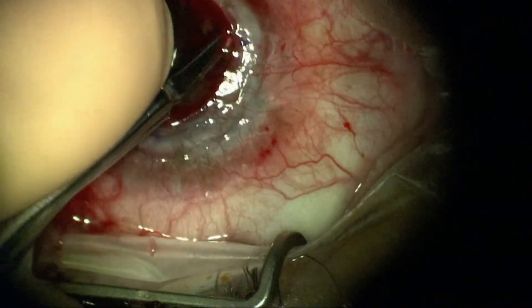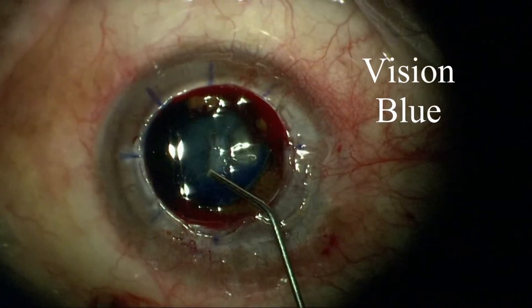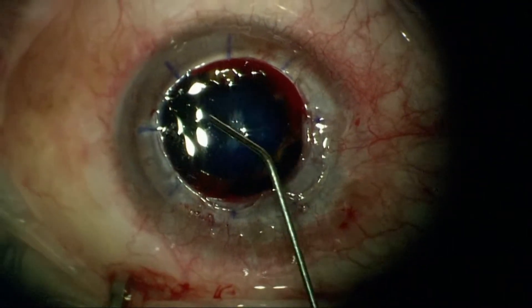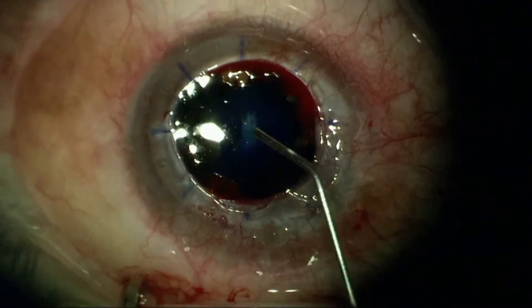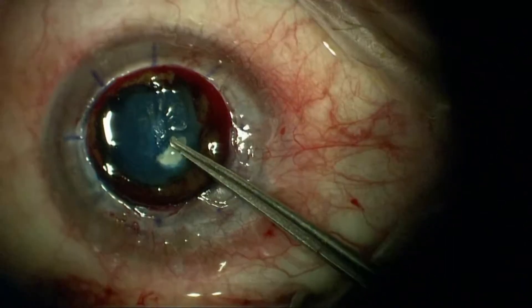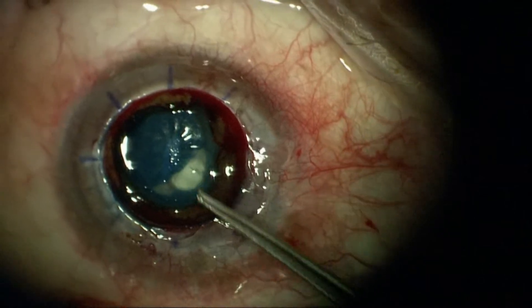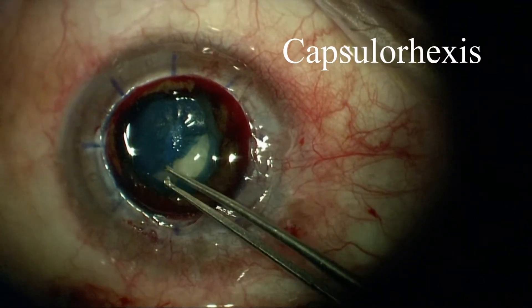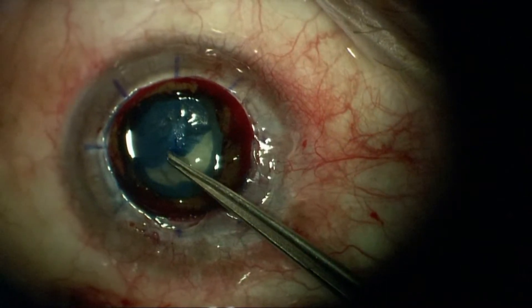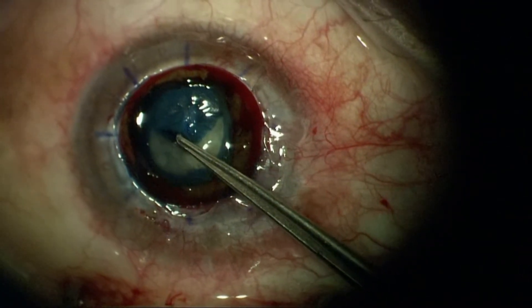This is a synechia here that requires sharp dissection since it did not resolve with blunt dissection and visco dissection. This is vision blue — an attempt to better outline the capsule of the cataract. Controlled entry here with the superblade; a lot of back pressure, so I've got to be very careful that the back pressure doesn't cause the tear to run out into the periphery.